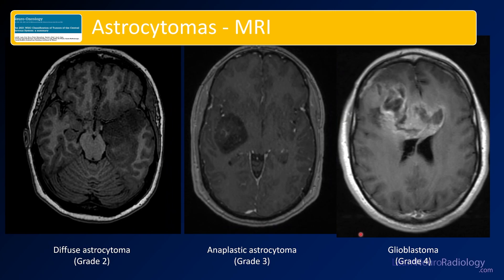This is an MRI summary showing the same spectrum. You've got that temporal mass that looks not too bad for the grade 2, a little bit of enhancement for the grade 3, and by the time you get to the grade 4 lesion you've got pretty bad heterogeneous enhancement — a really heterogeneous-looking mass.